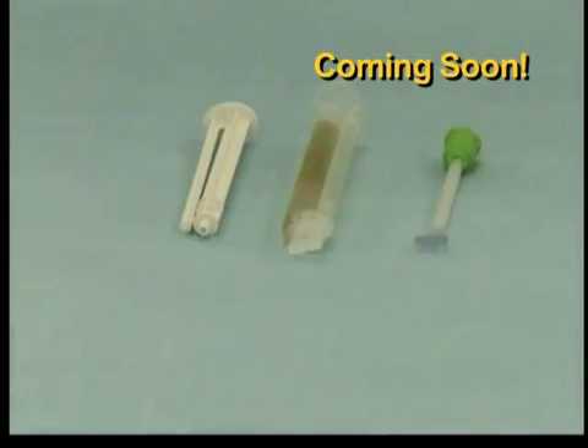Here are the components of the BioGlue syringe system. The spreader applicator tip can only be used with the syringe system. The following scenes demonstrate the assembly of the syringe using the spreader applicator tips.